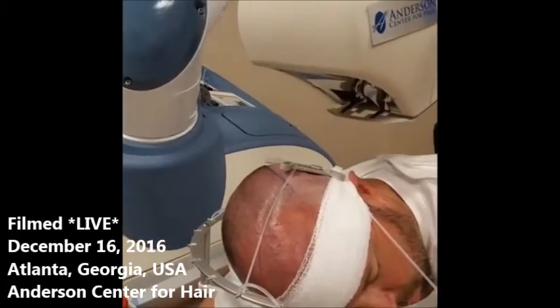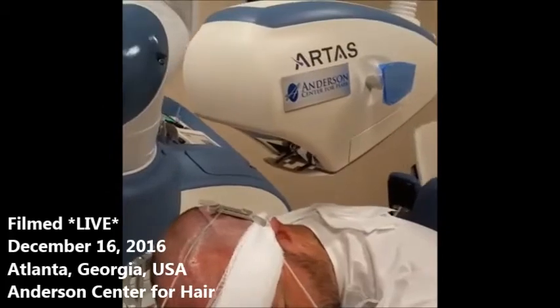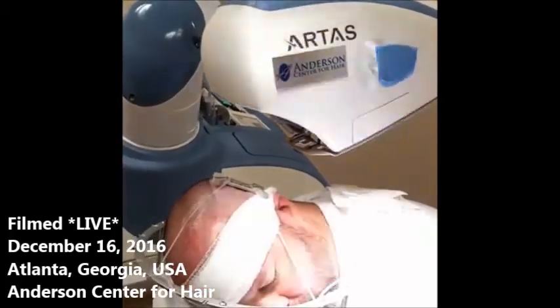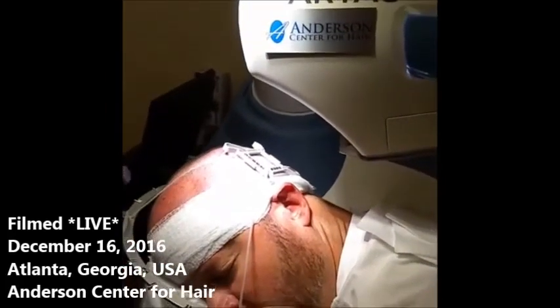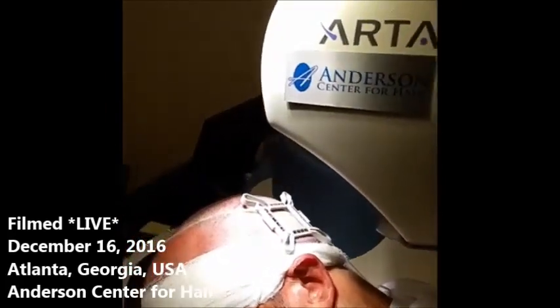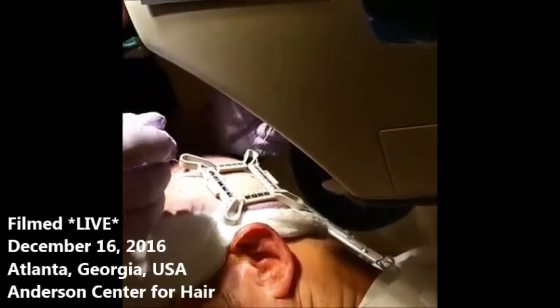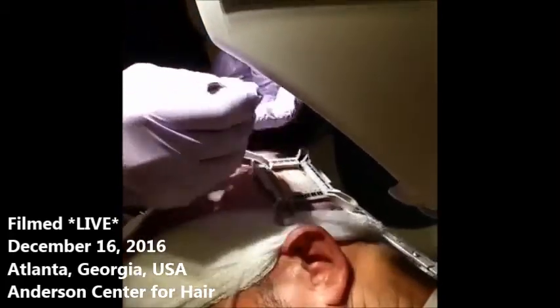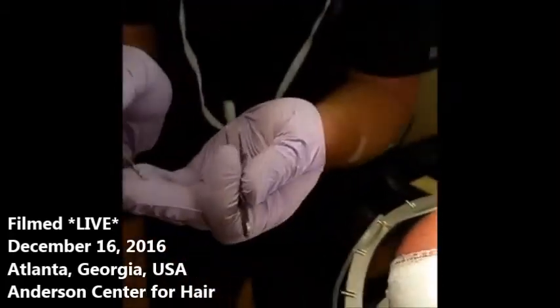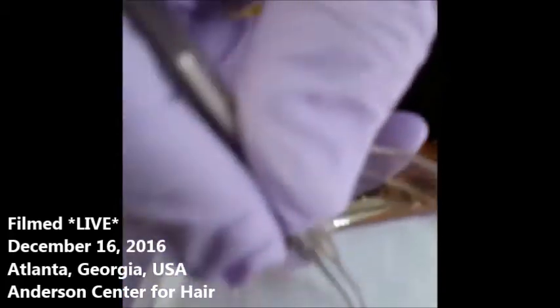I'm going to put some gloves on, and we're going to turn on our Star Troll LED surgical lights — nothing but state of the art. You can see the tension even stops the bleeding, so there's very little bleeding from this area. I'll just extract one graft for the audience — there you can see a beautiful graft, a nice follicle — and we'll go ahead and put that in the dish.